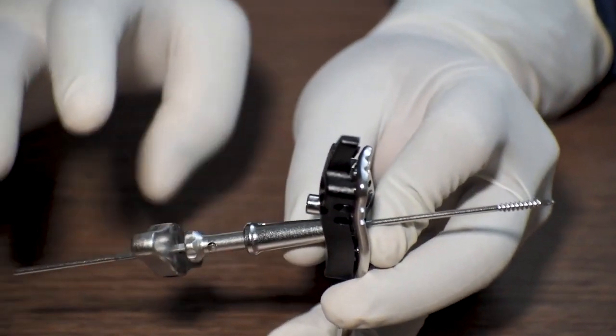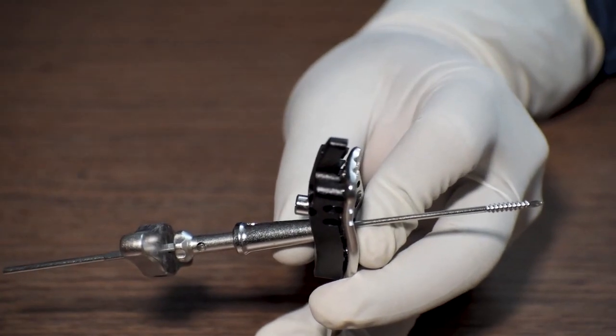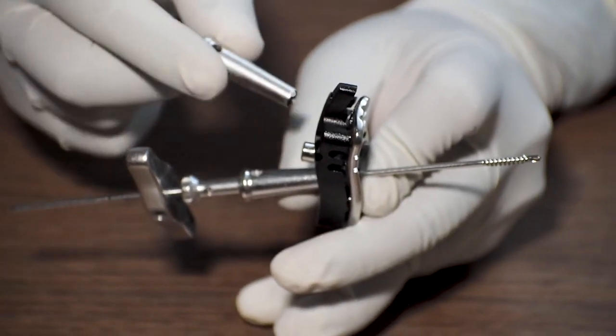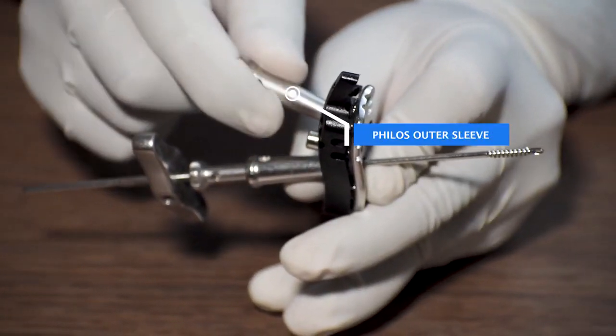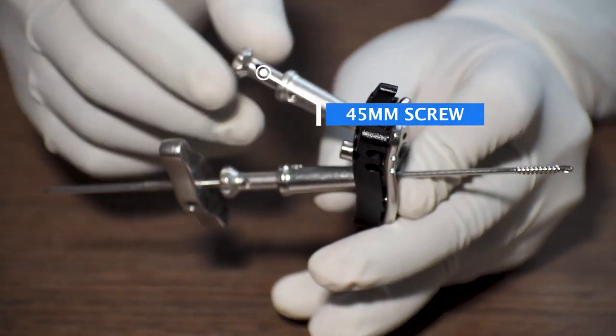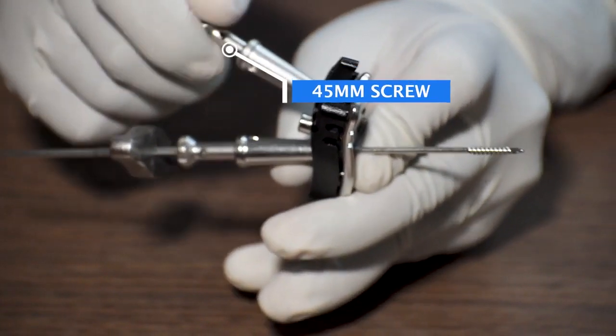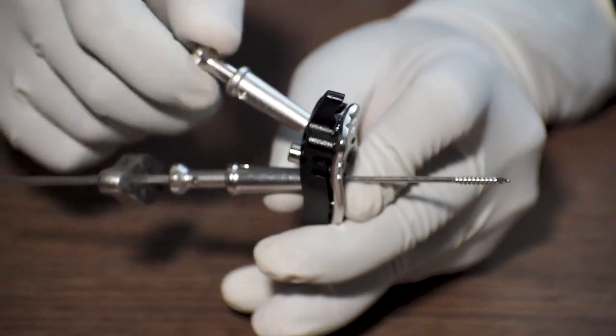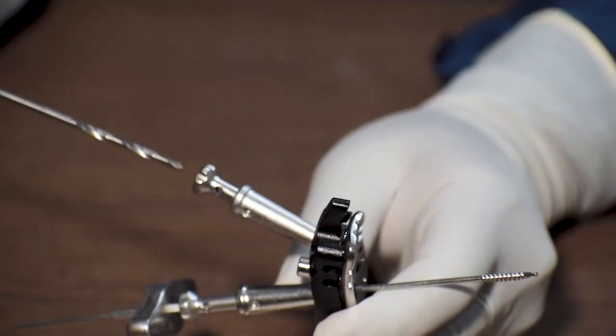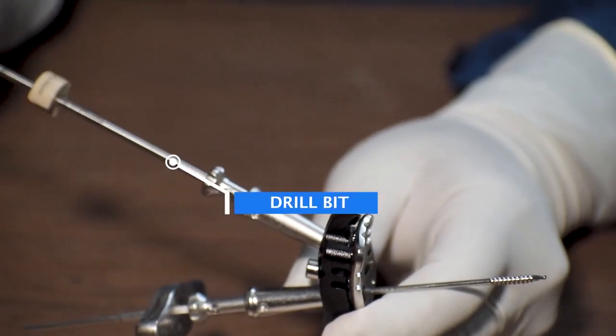After this procedure, we will attach another Phyllos outer sleeve in the jig in the desired hole. Then we will again attach a drill sleeve. Then we will use a drill bit to drill through this drill sleeve.